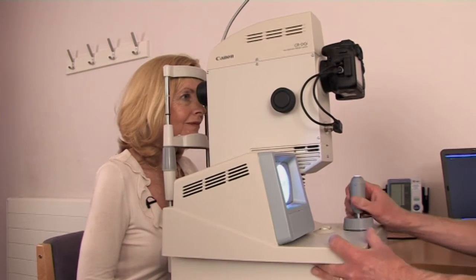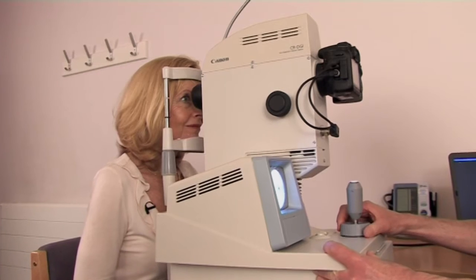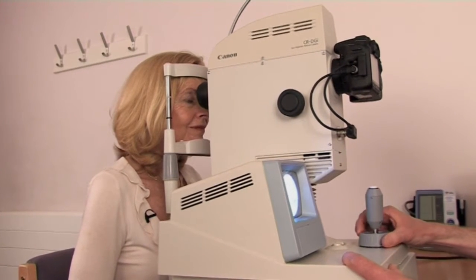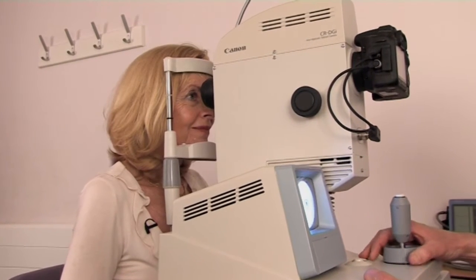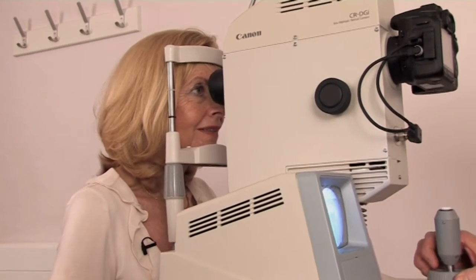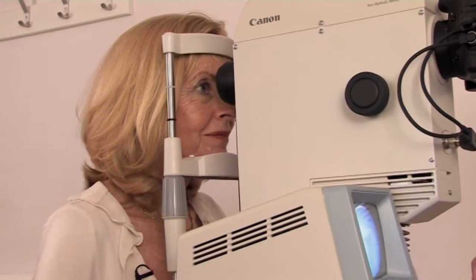Now, all I need you to do is look directly ahead, and you should see a little orange light. If you stare at that orange light for me, it's going to change to a green one just outside the camera. That's it, that's perfect. Keep watching that little green one, and hold that nice and steady. Both eyes nice and wide for me. Lovely, that's one done.